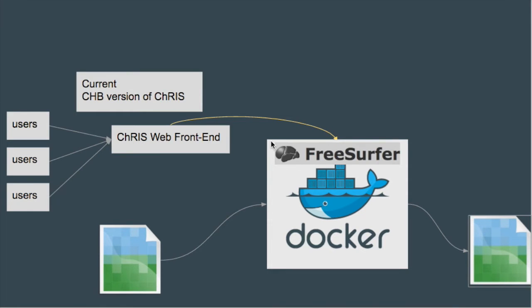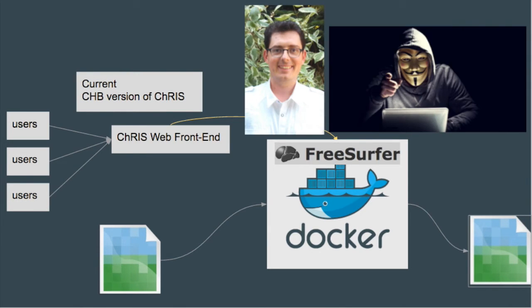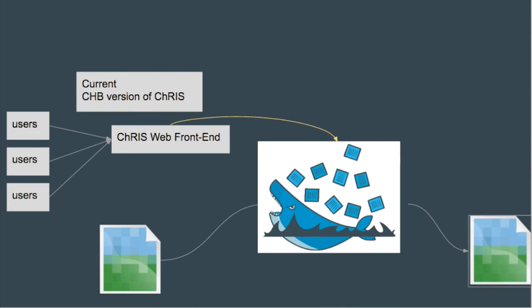As luck would have it, Dockerizing the back end manages to make security at least slightly more of a sure thing. If the system were to be targeted by, let's say, some unsavory individuals, if it went bad, that is to say, if files within it got corrupted or if it got fork bombed, what would ultimately take the hit would be the lightweight container, which we could eliminate without too much of a problem, and then just spool up another one while we worked out the security hole.